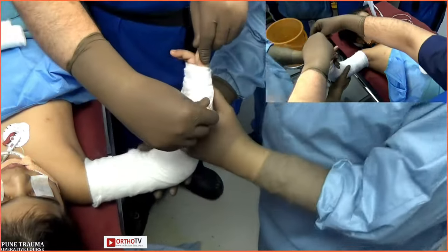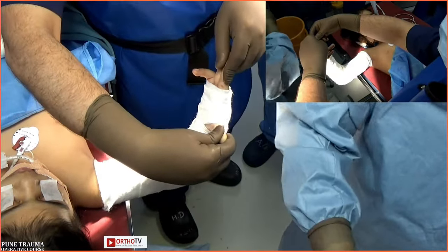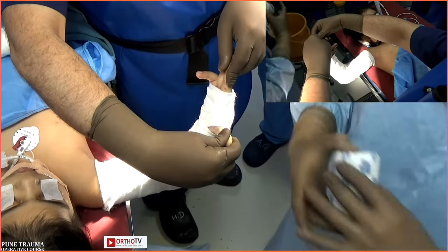You should not get a lateral view before casting. Shouldn't we see the lateral view before casting? People want to see the lateral view. Yes, on the C-arm.